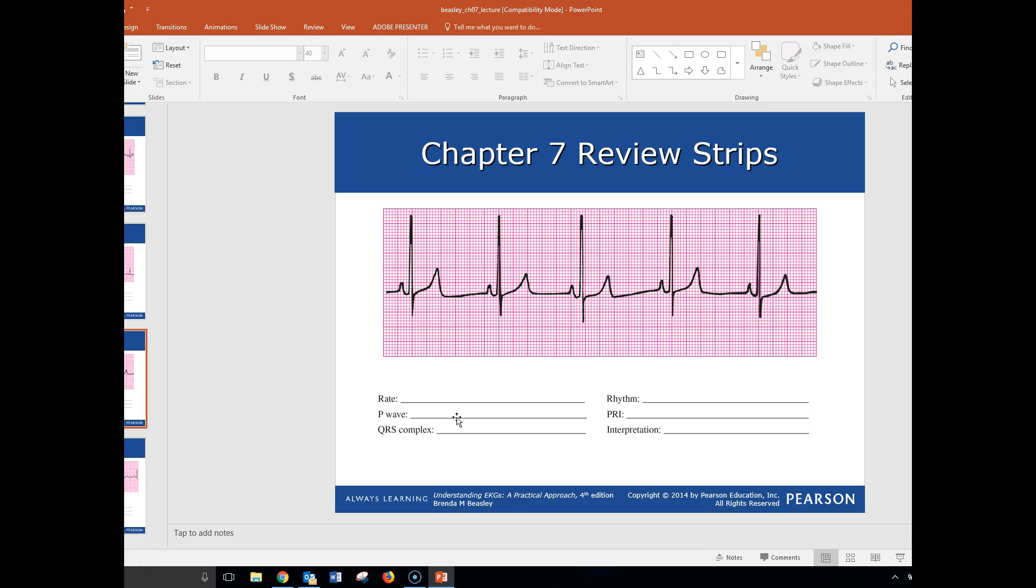What we're going to do first off, we're going to talk about the rate. Remember these numbers, and you should have them hopefully written down already, but write these down: 300, in this order, left to right, 300, 150, 100, 75, 60, 50. It does go on to 40, but we'll stop there.